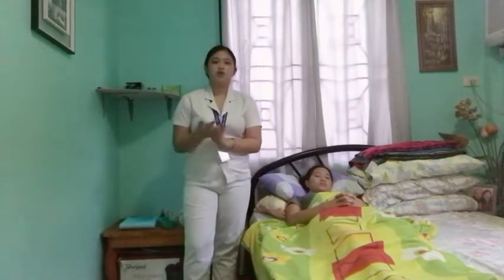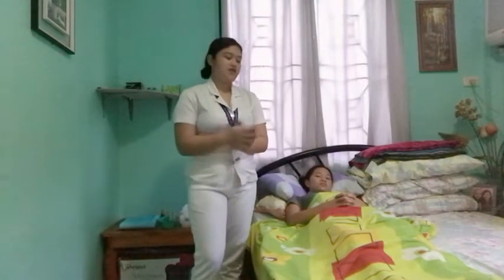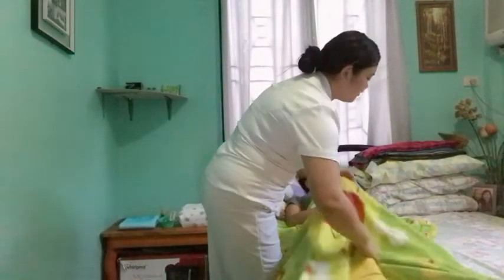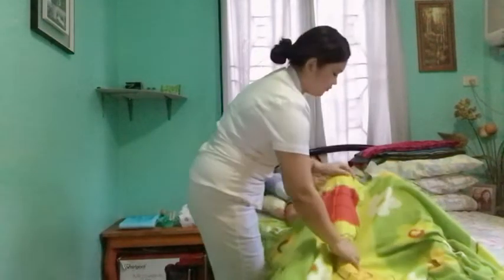Ensure to screen the patient or lock the door before doing the procedure in order to provide the patient's privacy. Then position the patient in a recumbent position with knees flexed, for this would be a good visualization of the meatus to introduce the catheter. Okay, Ma'am Dayan, so I need your knees to be flexed. Okay.